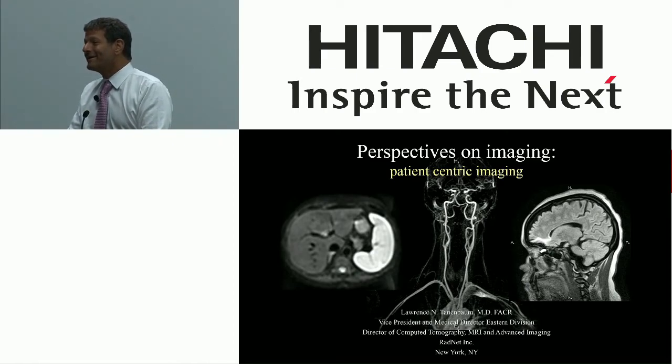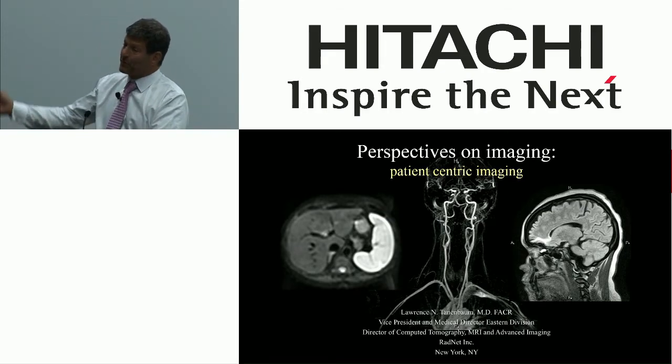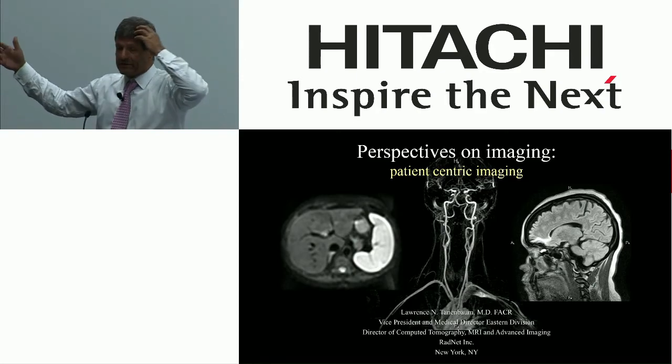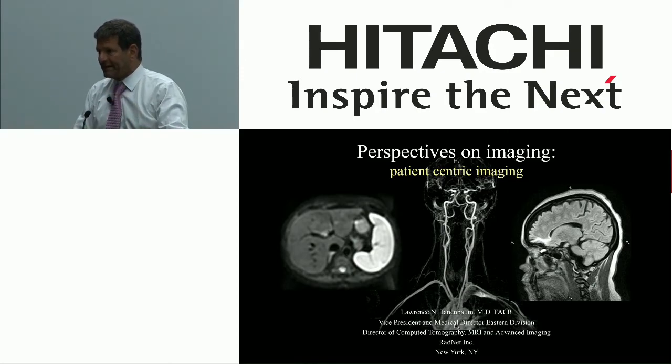So I'm wondering if you have an IV sedation business, and has this technology impacted that? You know, I don't have an IV sedation business much in our RadNet that I know about. Frankly, I would have no hesitation sedating a patient and putting him in there, but my goal for these machines is to help me avoid sedation. Once I sedate the patient, I can use any scanner, but I don't have a problem with that. And there is a state where this would give you that extra advantage.